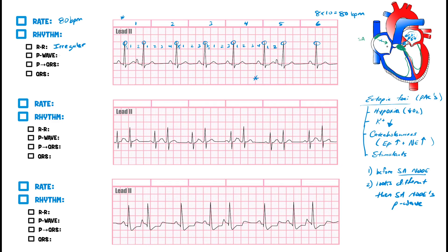Next, we look at P waves — are they all the same? Here's a normal P wave, and here's another that looks the same. But this one is definitely different. An ectopic PAC comes earlier than it should. That shorter R-to-R interval confirms it came early, and the P wave looks completely different from the normal ones. So we call this a PAC.